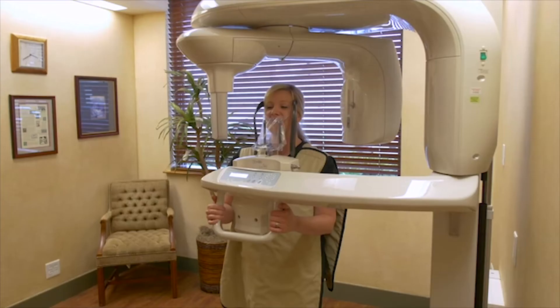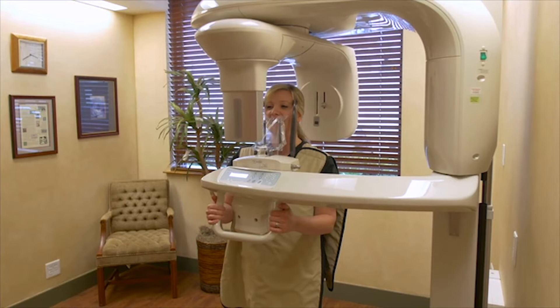From the beginning of modern endodontics we have relied on the radiograph as a critical part of our diagnosis, prognosis and treatment. Today we have an additional tool that has quickly become the standard — cone beam computed tomography, or CBCT. The American Association of Endodontics and the American Academy of Oral and Maxillofacial Radiology issued a joint position statement on when CBCT should be employed.